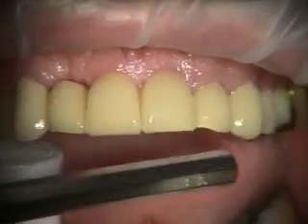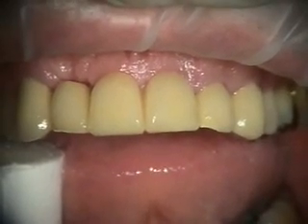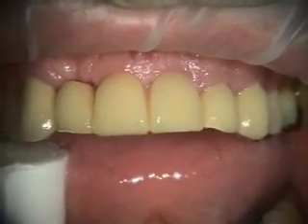This bridge will end up being a bridge from 7 to 9, and then individual crowns on 6, 10, and 11. We're going to be using this pneumatic bridge remover.